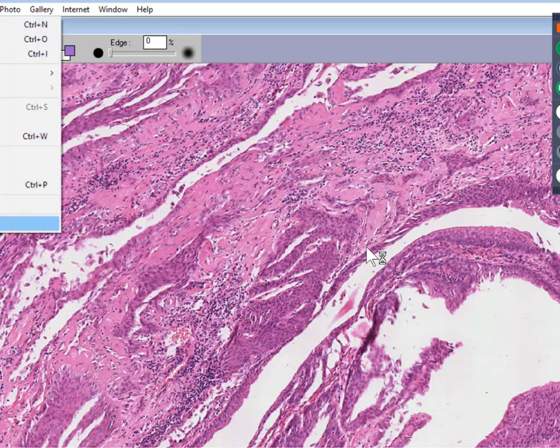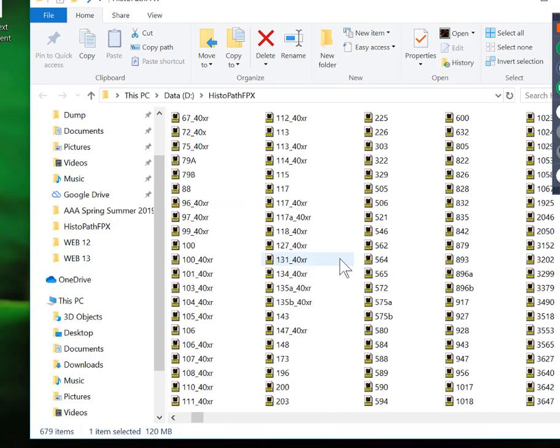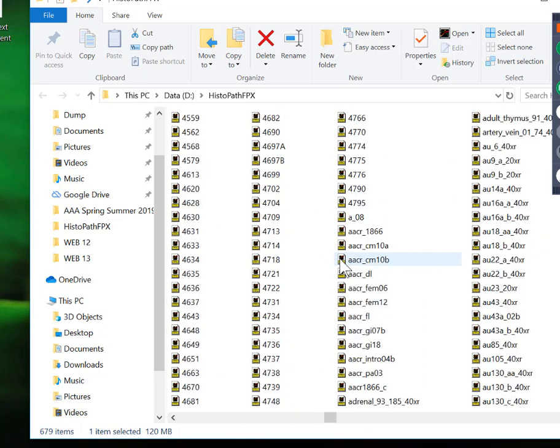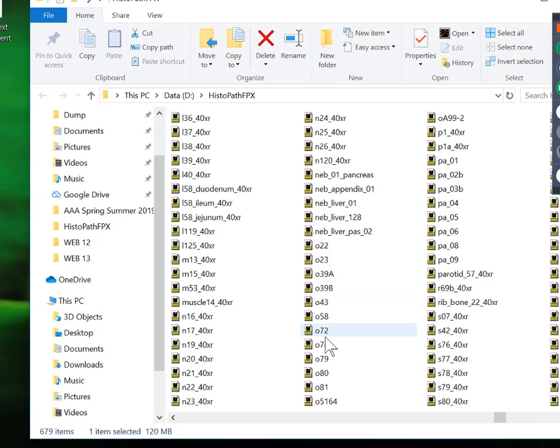Let's go into another pathology case. And we'll go to number 079 now. 079 is going to be right... whoops. Oh, it's the letter O. It's not the number 0. So there's A, C, H, I, K, L, M, N, O. 79 is over here.